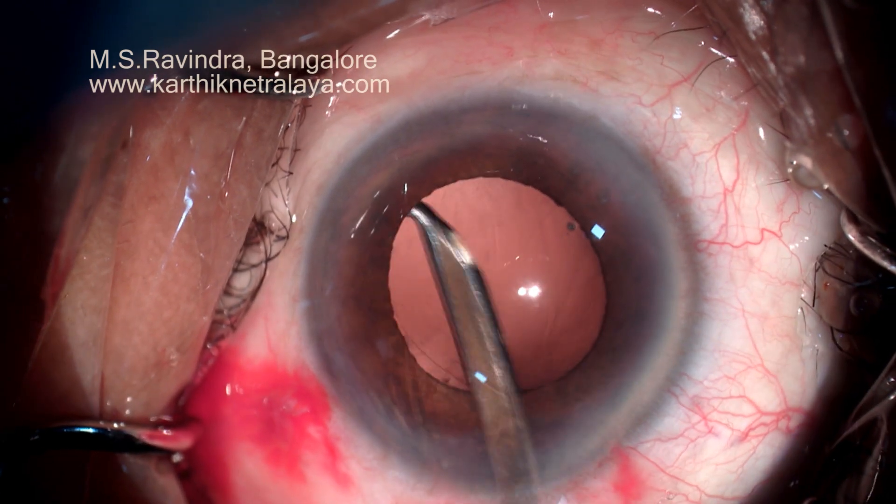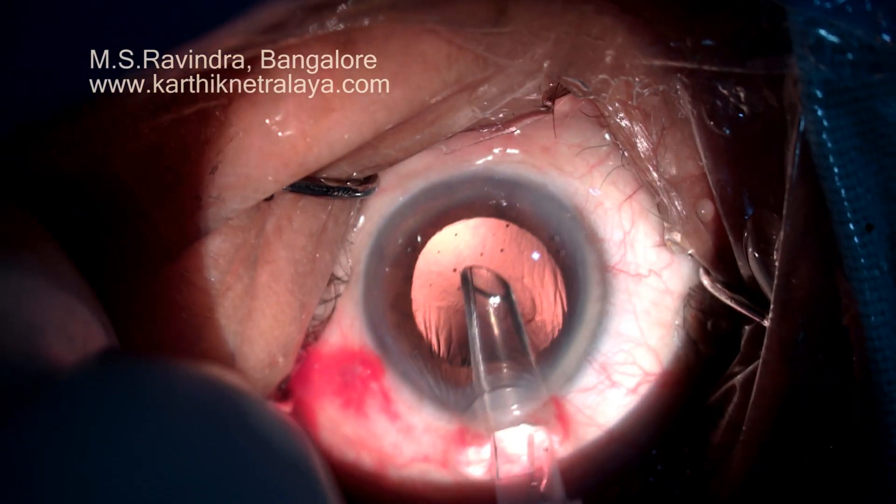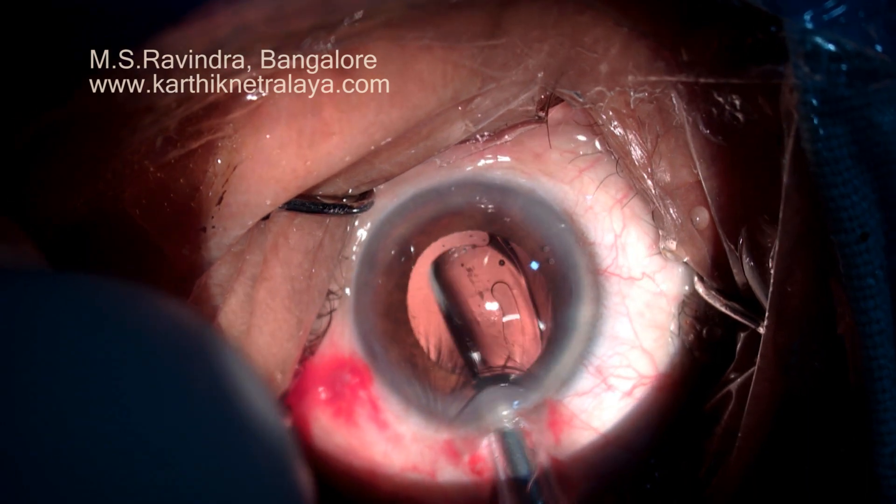As there are no side ports, this is a single-entry surgery — there is only one tunnel through which the surgery is done. So, sub-incisional cortex has to be removed by a J-shaped cannula.